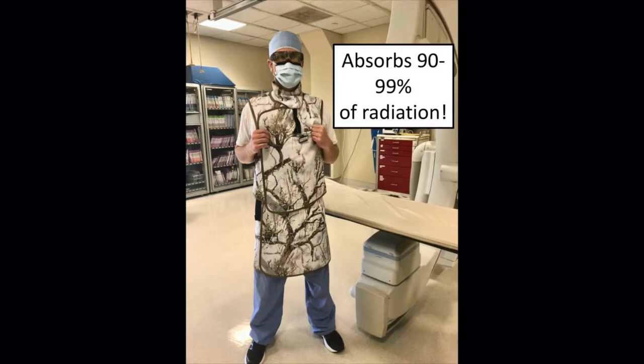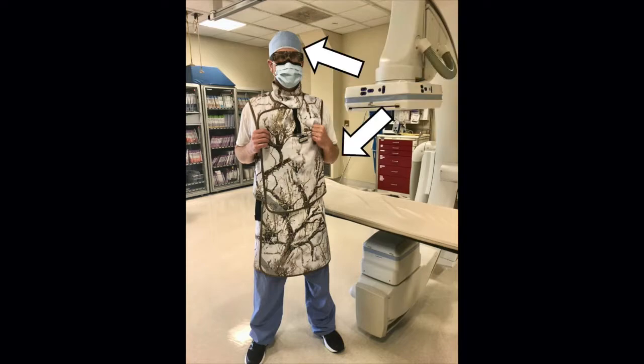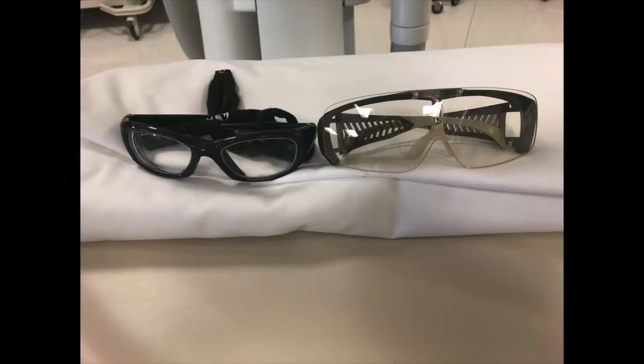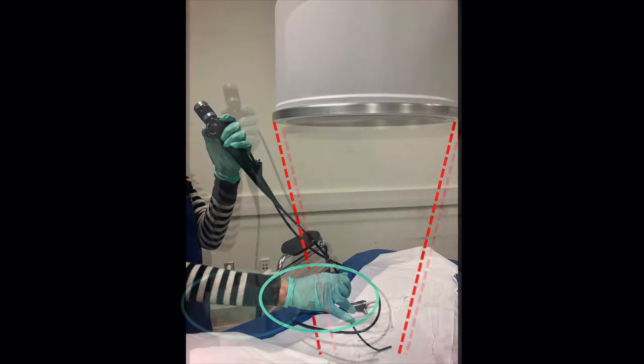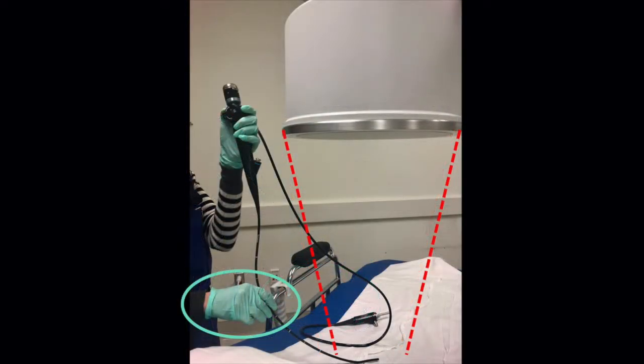Lead aprons or vests can absorb between 90 and 99 percent of radiation scatter, depending on the thickness of the lead. However, they leave the extremities and the head unprotected. Increased rates of cataracts have been documented in fluoroscopists, so lead glasses should be worn. Additionally, fluoroscopists should take care to avoid irradiation of their hands, which are at the highest risk for chronic exposure. Be sure to keep your hands out of the direct beam unless absolutely necessary for the procedure.